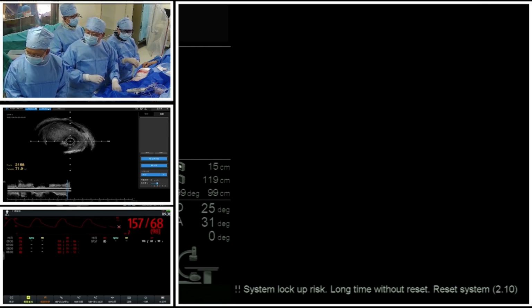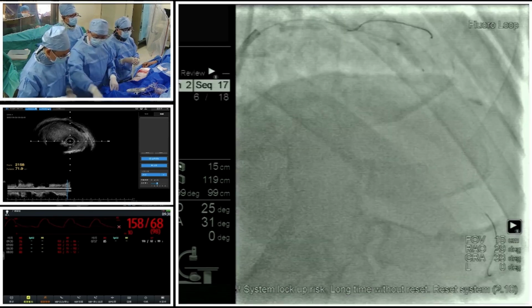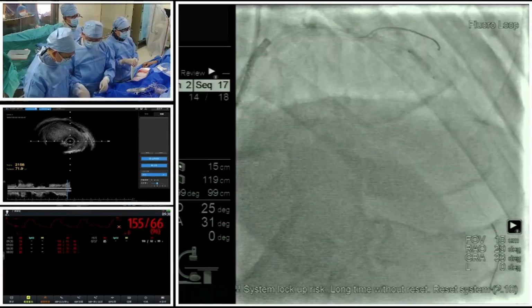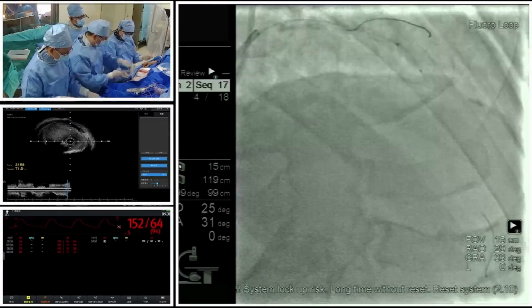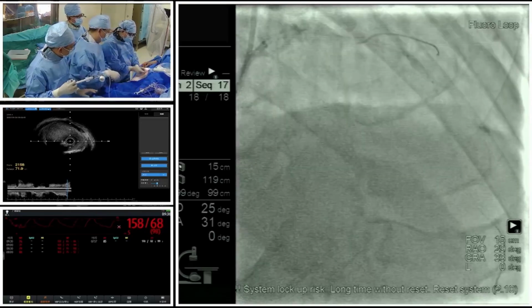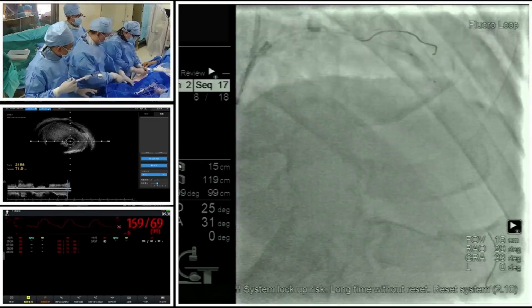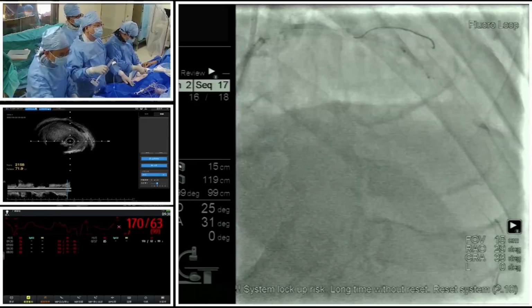For the stenting, because the lesion is kind of diffuse, I think there's no good spot to land the stents at the proximal LAD. That's why you want to cross the circumflex, right? Two stents, yeah, and the second stent has to cross the circumflex. Yes, the second stent will cross over, because of the left main, it is not a good landing zone. So we decided to perform a crossover strategy.